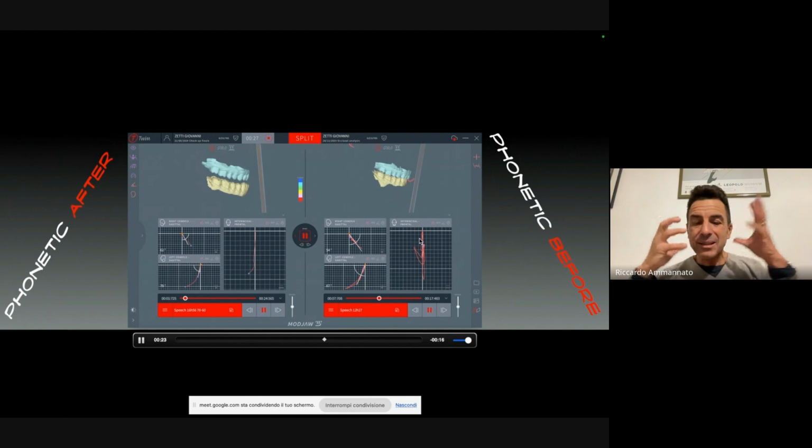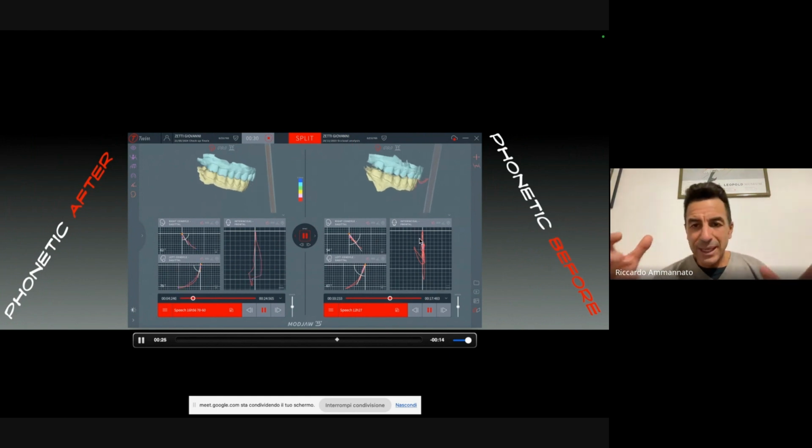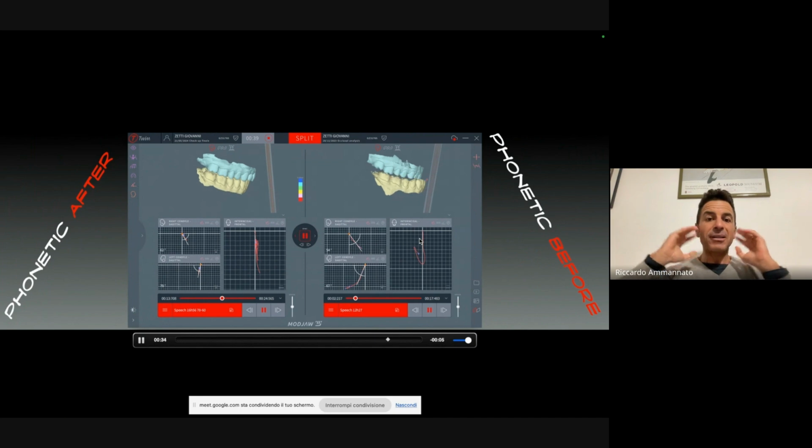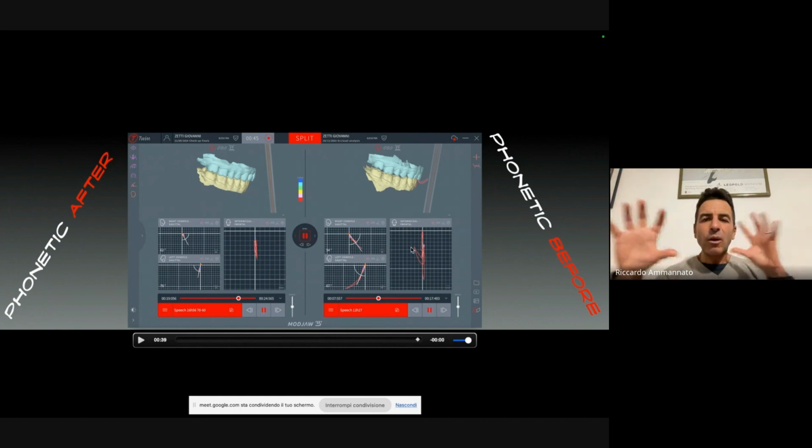So also the muscles, as in the previous lecture, when we are doing restorations, we also need to rebalance the muscle part, the neuromuscular part, and all this we can see here, that this is much more in balance. You can see from this kind of movements compared to the initial side. So the digital jaw tracking is giving us this kind of feedback.